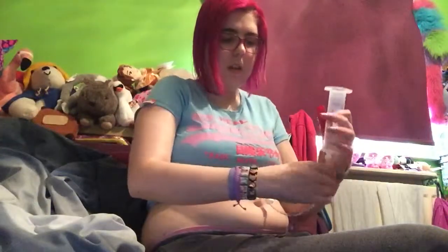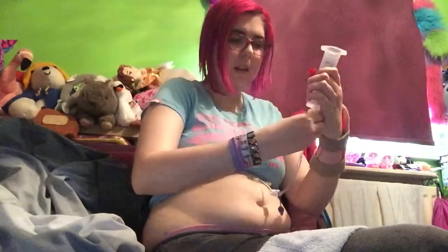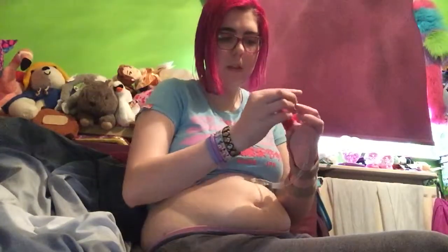And I'm just going to unscrew this. Always, in case there's a little bit of water left, have a little face towel or face cloth. So that's that there, and that is clamped. I'm just going to put the protector on the top of this. And this is what you would measure the medications out in and pour the medications into the PEG.